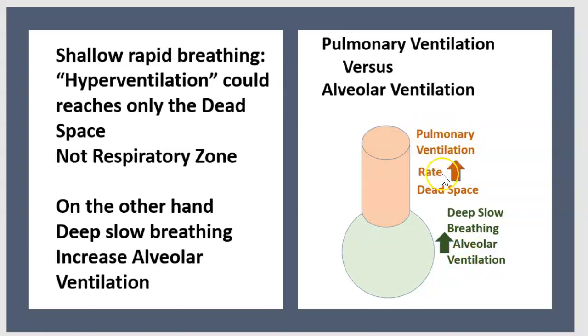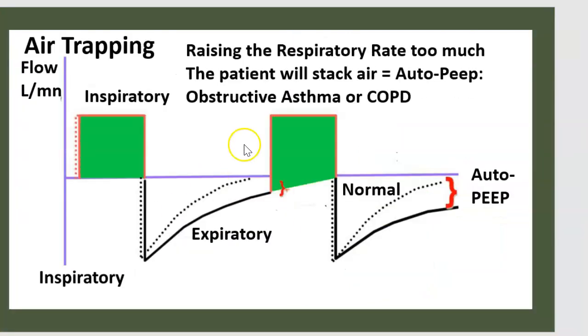Pulmonary ventilation rate increase reaches only the dead space. Raising the respiratory rate too much, the patient will stack air. It's auto-PEEP: obstruction, asthma, or COPD.